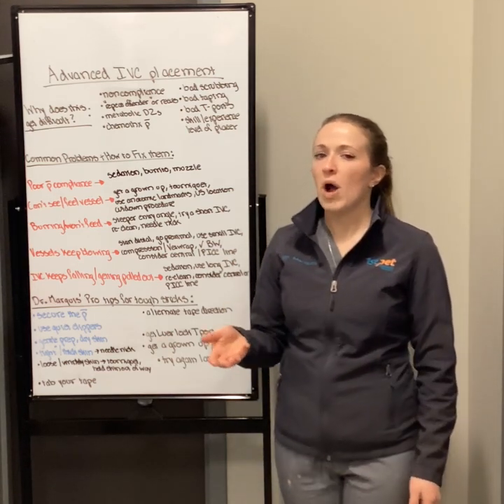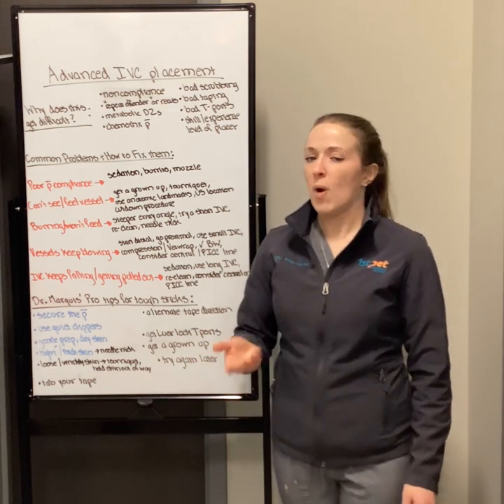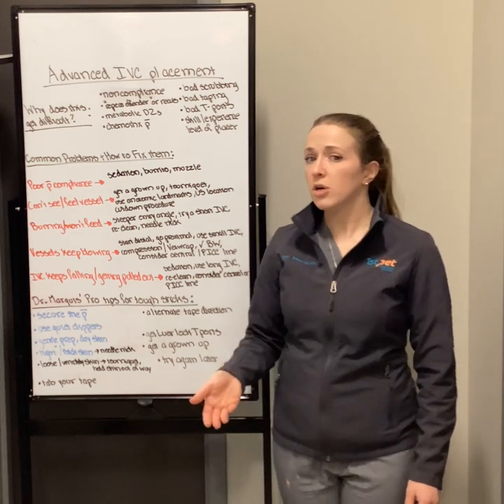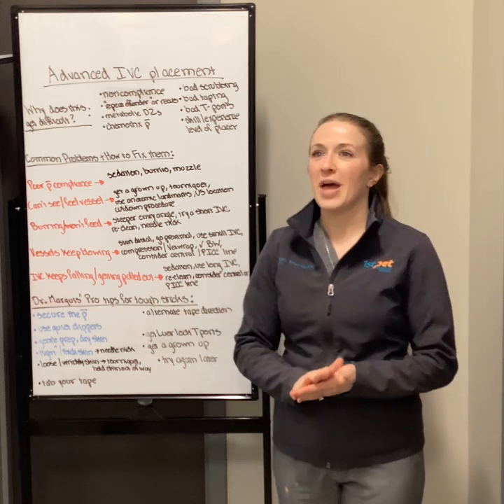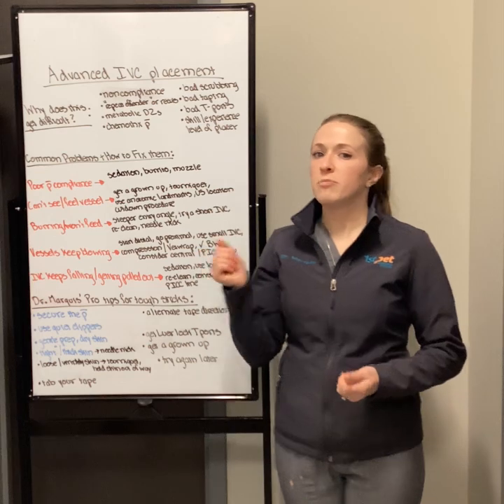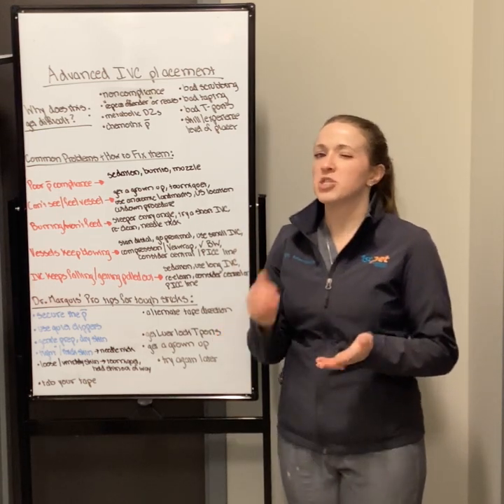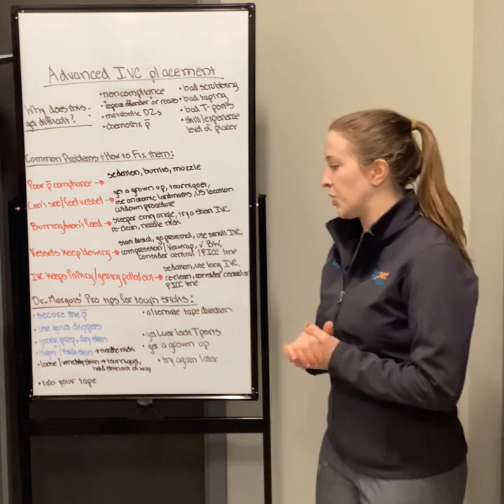So you might say, why does the clipping have anything to do with this? Well, if you get a pair of quiet clippers, and you can get them on Amazon for not very much, the dog or cat is more likely to be compliant in letting you shave the leg. And if the dog or cat is not afraid of that, you're going to be able to shave the leg better, get the hair off the leg, clean the leg better, and then make the catheter more secure. If you have to do a flimsy shave job because you have rickety old clippers and the dog or cat says, absolutely not, that sounds really scary, then that might make securing your tape really difficult, and then your catheter falls out. So those are how those things are related in my eyes.